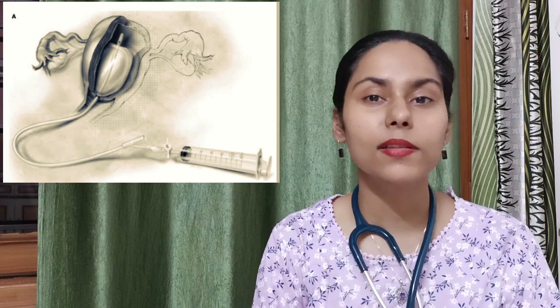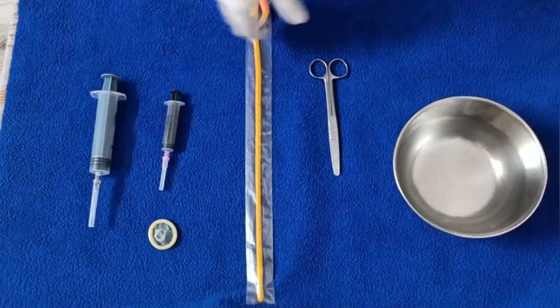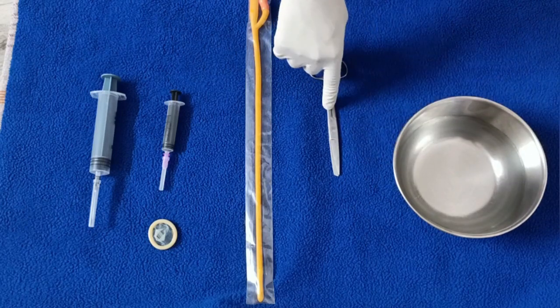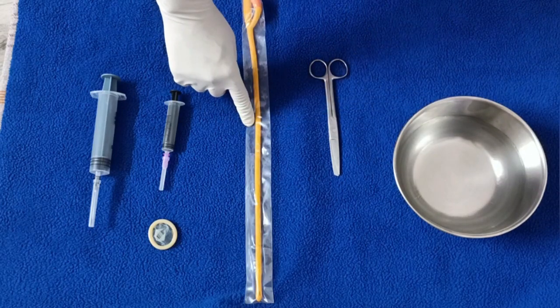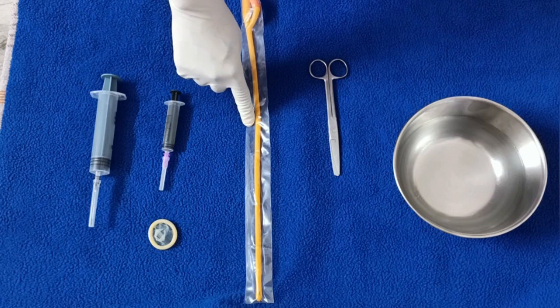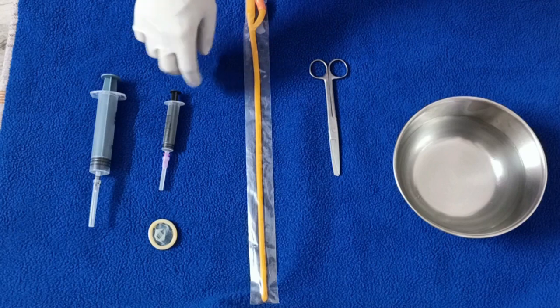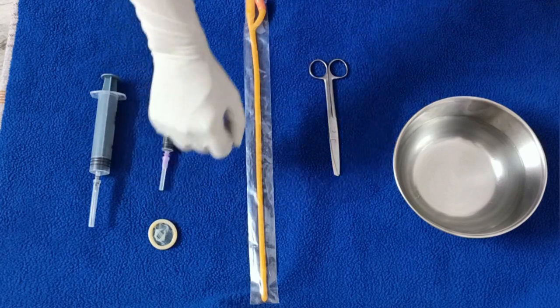Now let's make this CG Balloon. To make a condom catheter we require a sterile sheet and bowl with some normal saline, a pair of scissors, a catheter — which ideally should be number 22 but here I have a number 16 — some syringes, and a condom.